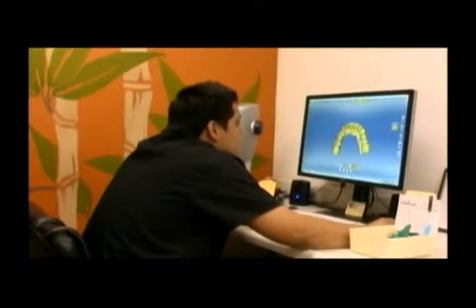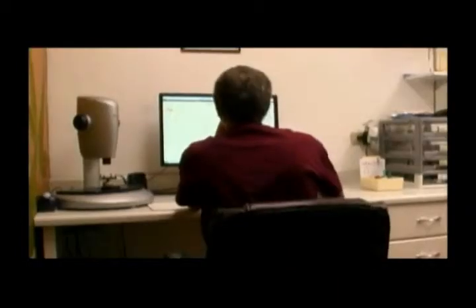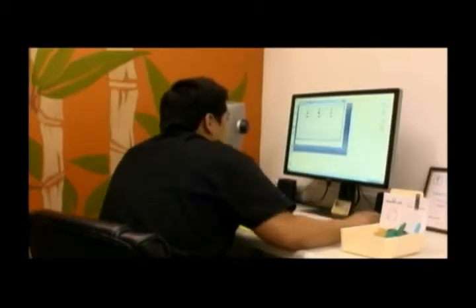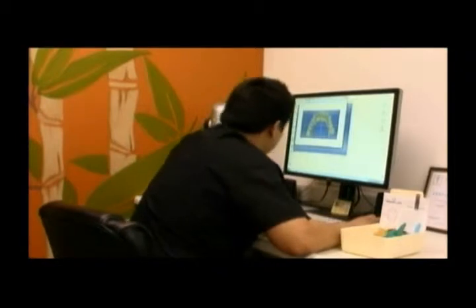A digital picture of the occlusal view of your setup model is created and imported into the Lamdabot software. There, you define the working parameters and the wire's reference points. The software calculates the displacements from the reference arch and converts them into instructions for the robot. Your design then can be saved as a project for future reference as needed.